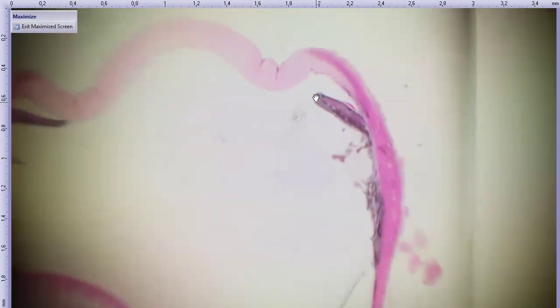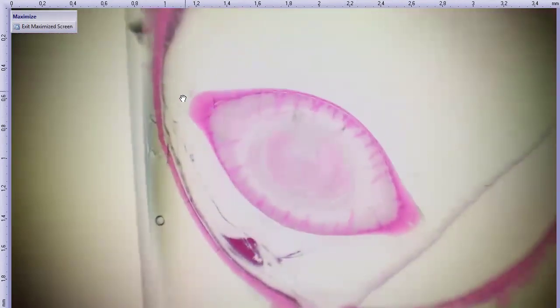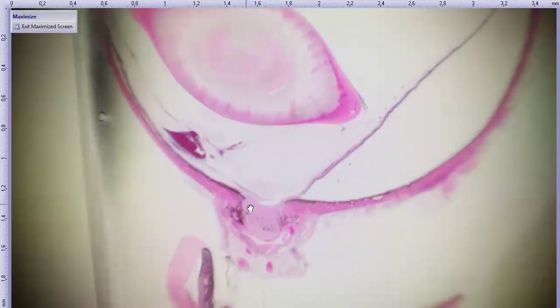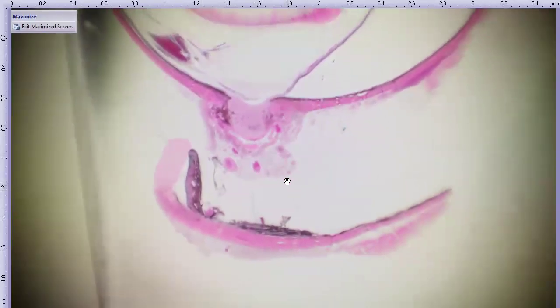All right. So again, cornea oriented at the top there. We have our iris leaflets here. And it's probably a little bit hard to see from the subgross view, but we start to see little whispers of membrane formation on the ciliary body and a little bit here on the lens capsule. Here's a little bit of hemorrhage, and we can see some cupping of our optic nerve, which is more glaucomatous change.